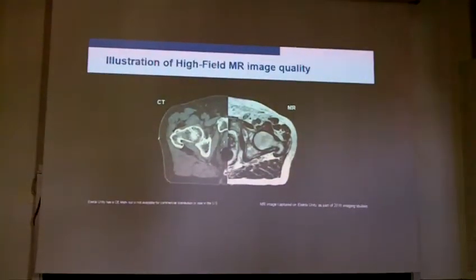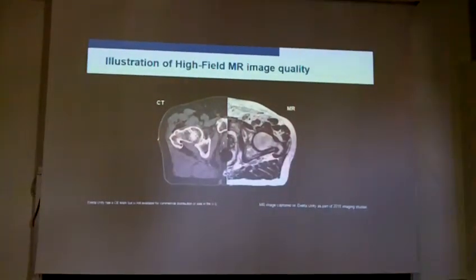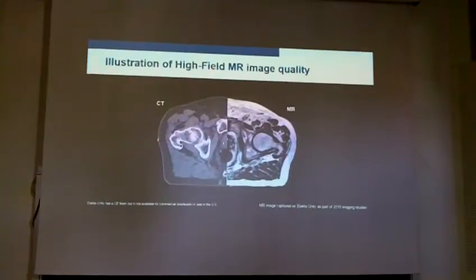When we introduced the cone beam CT, it was really a great improvement over previous technologies. And for certain anatomies, it's really, really good. But still we have some uncertainties and challenges, as we also saw in previous presentations.